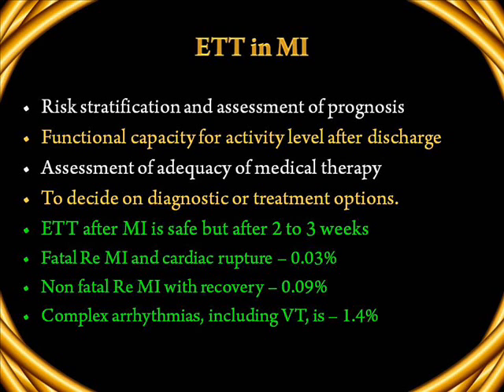Sometimes it is important to decide further diagnostic and treatment options in a patient who suffered myocardial infarction. In such cases, ETT may be useful. Remember that ETT in MI is safe, but not immediately after MI, but after 2 to 3 weeks of time. Fatal re-infarctions and cardiac rupture have been reported, but the occurrence is very low, 0.03%. Non-fatal recurrent infarction with recovery occurs at a rate of 0.09%.